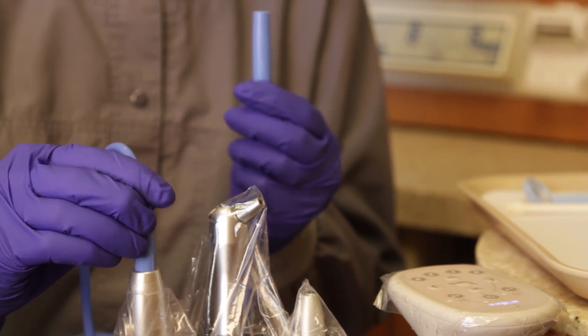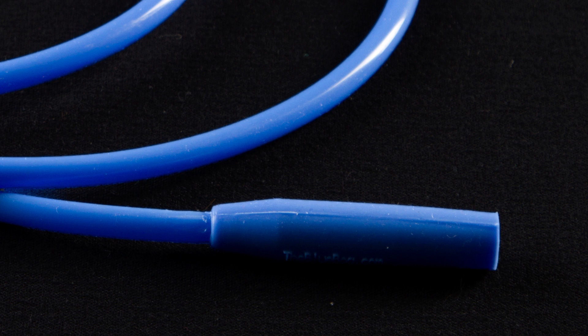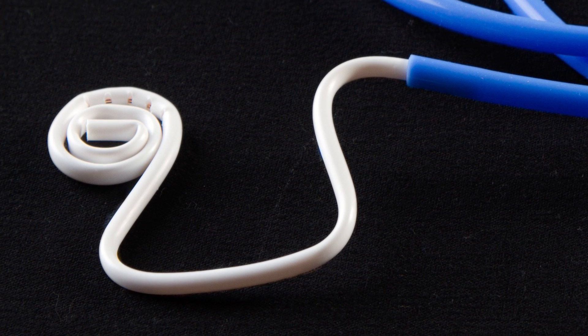The BlueBoa adapter fits directly into the high-volume evacuator. It has a tapered end that provides a snug fit. The other end of the BlueBoa works in conjunction with a saliva ejector.